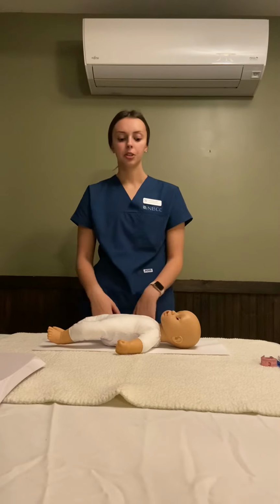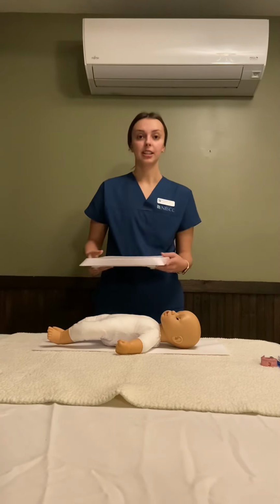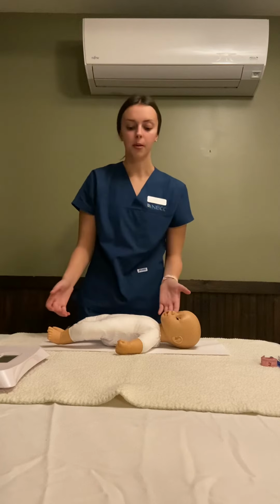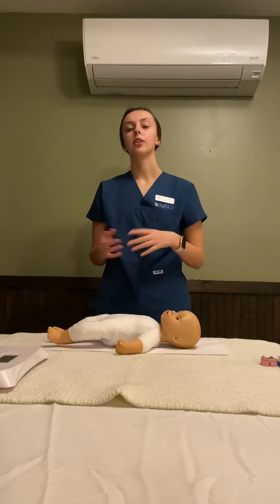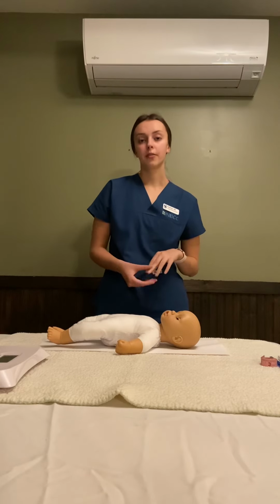And then I'm going to weigh the baby. So typically you would have a bigger scale like this that the baby could lie on, and it's like this long. So it looks like a little table. And then you would lie the baby on it, and you press on, and then the weight will come up, and typically the normal weight would be between 6 and 9 pounds. And babies will lose 5 to 10% of their birth weight.